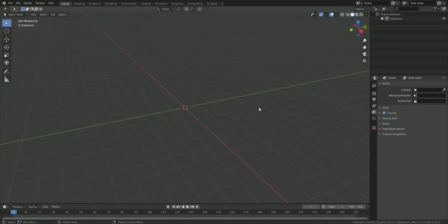So after I finished the segmentation, I repaired some artifacts on the model of the skull. I put a part of the frontal bone and the orbit in the 3D printer, and it was printed during the night. In the morning, I cleaned the supports and went to see the neurosurgeon and the maxillofacial surgeon. And here is the plan.